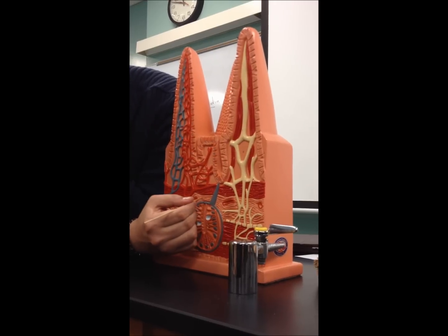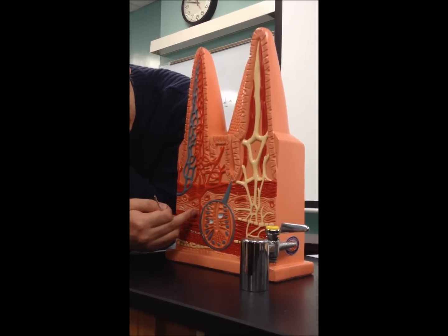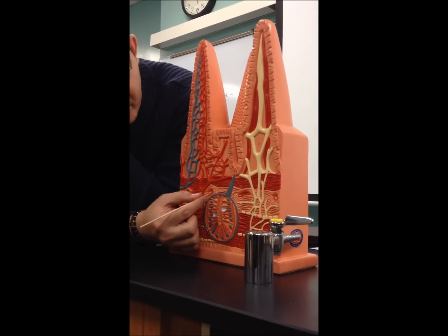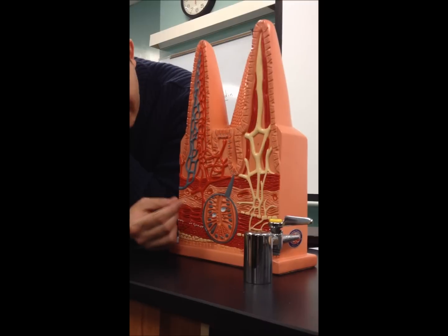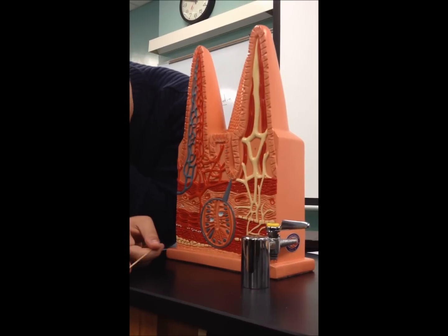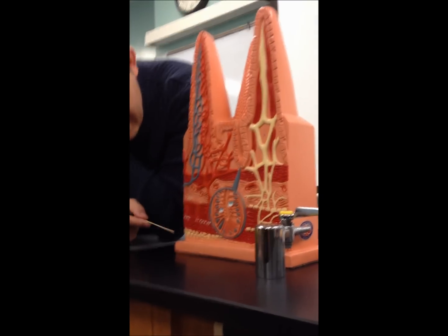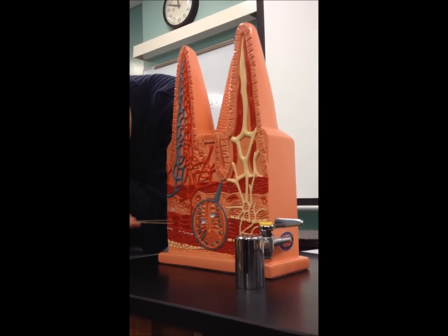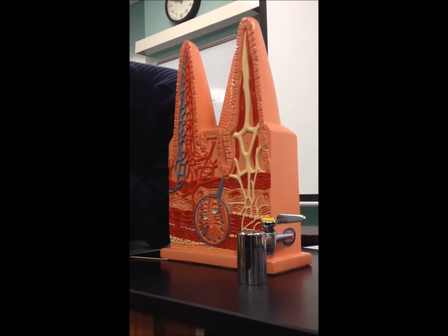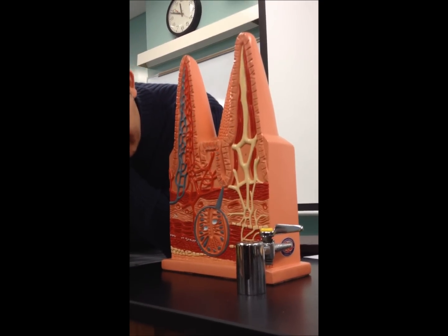The submucosa is dense irregular connective tissue. Look at the fibers. See the fibers? They have different alignments. You have glands here as well, submucosal glands. Under the submucosa, you're going to have the muscularis externa, and you can see the two different directions of the fibers. The inner is always circular, moving around like this, and the outer one is longitudinal.